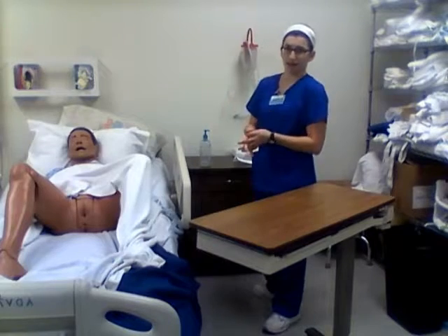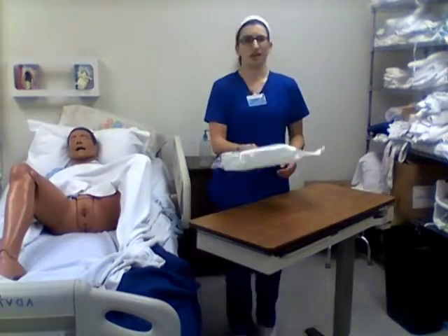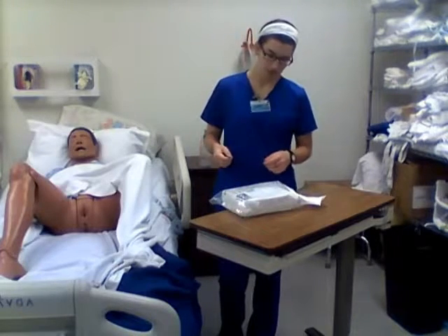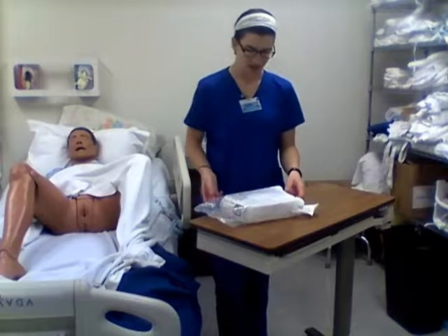All right, so now I can get out my catheter kit. We're actually going to put in the catheter now. And so this is my catheter kit. It comes with all the supplies I'm going to be needing for today. And so we're going to take this out.